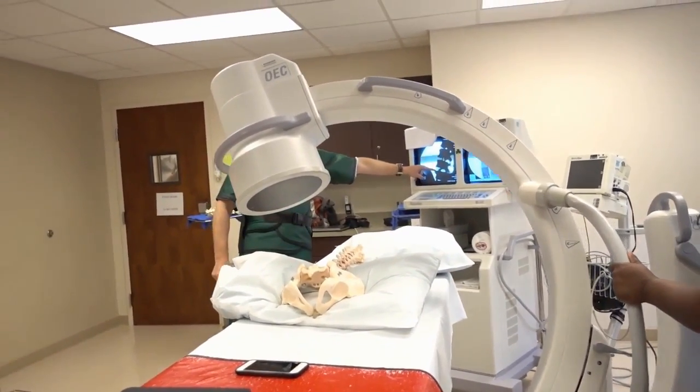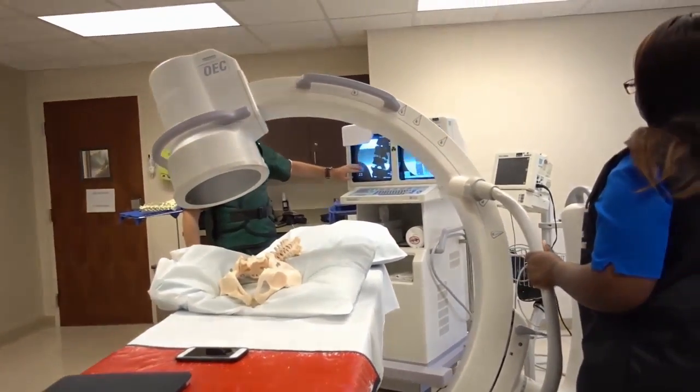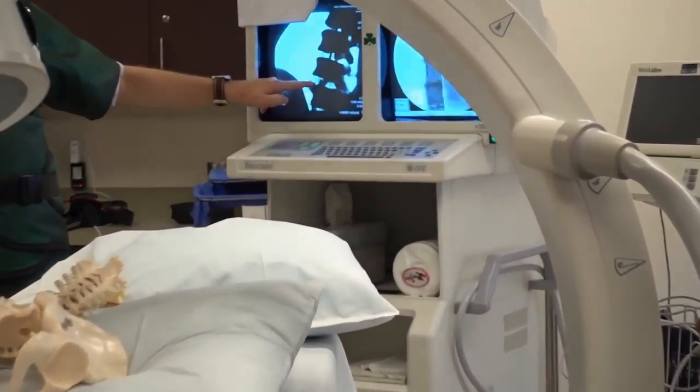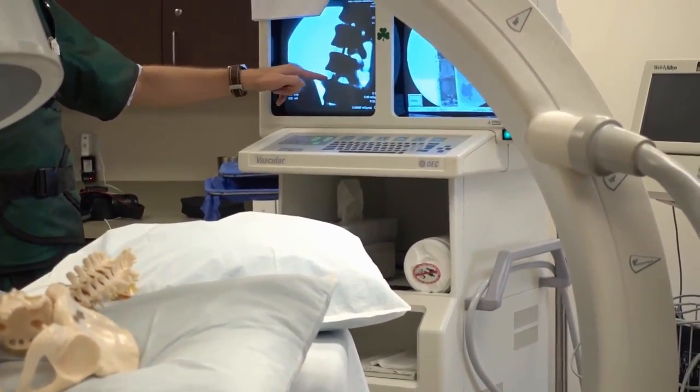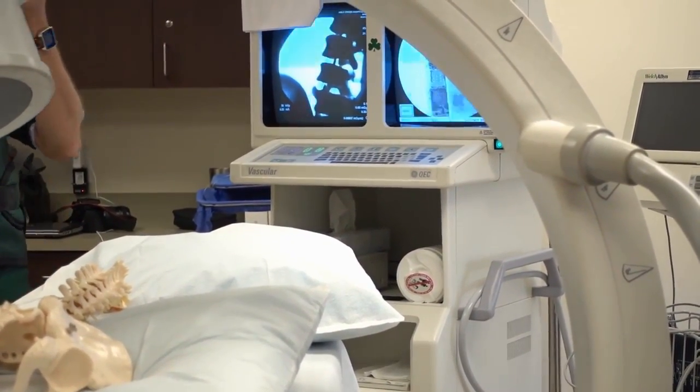But what we can see on the screen is the disc in plane, right? This disc is almost in plane. This disc is a little out of plane. Here's the wing of the ilium. The sacrum's going to be here. So if we were to do this Kambin's triangle retrodiscal approach, we come right down there. We can't see the pedicle or the Scotty dog here, but we go right there.